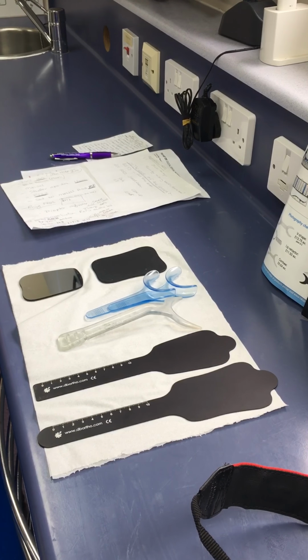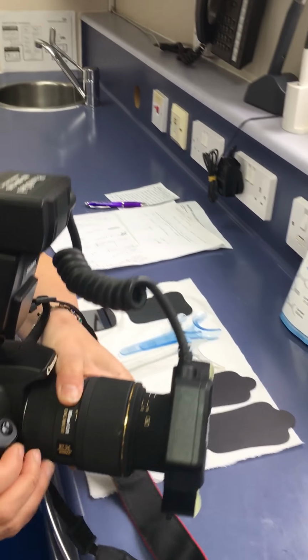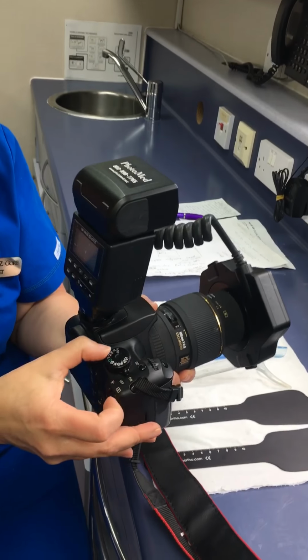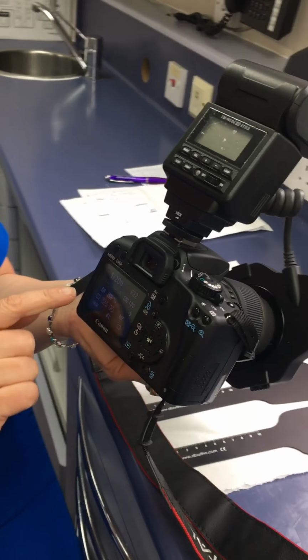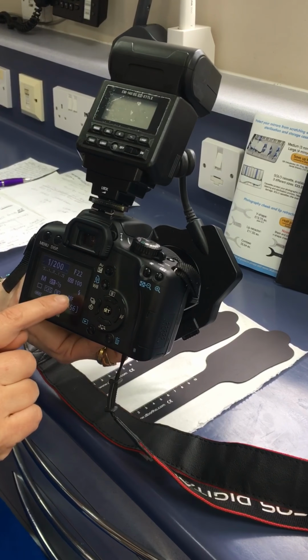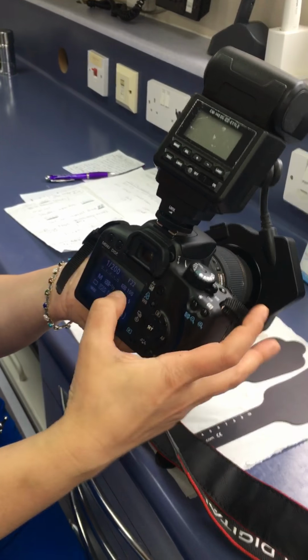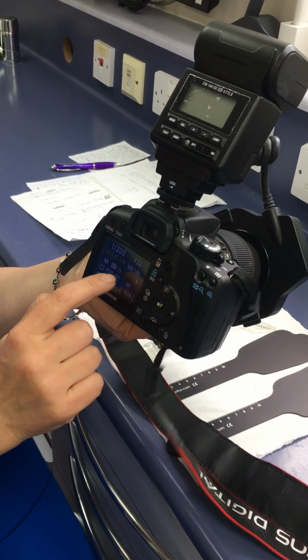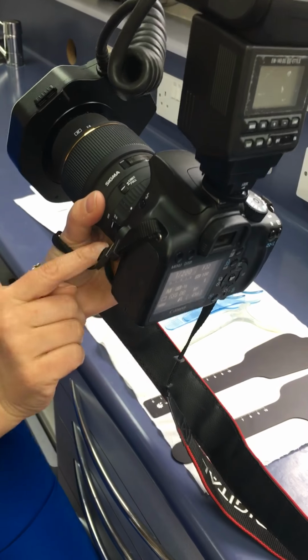The other thing you need to set on your camera, so let me just recap quickly. You set it on manual. You make sure that it's on F22 for the aperture size, 1 over 200 for the shutter speed, and the ISO is 100. So it says there 100, and the white balance is on flash. And the side should be on M for manual.